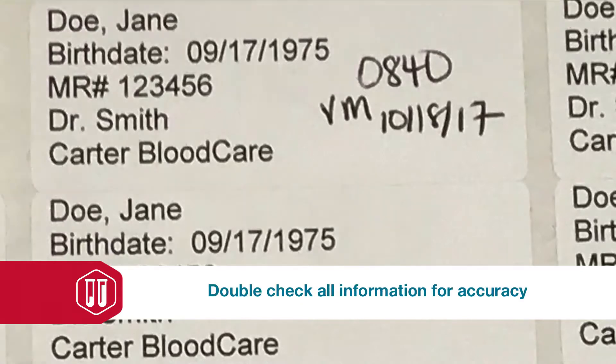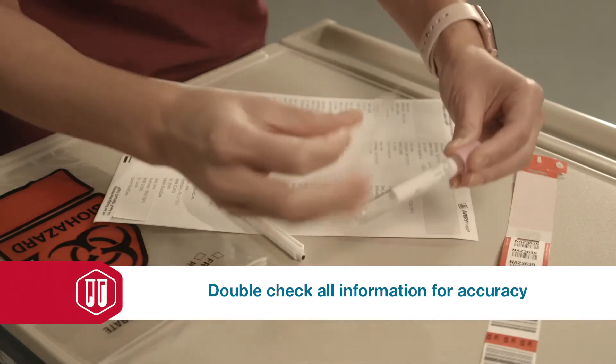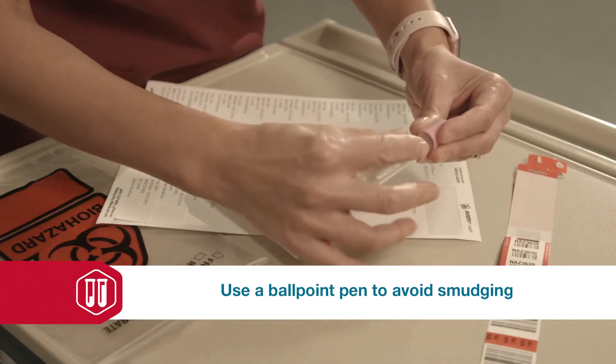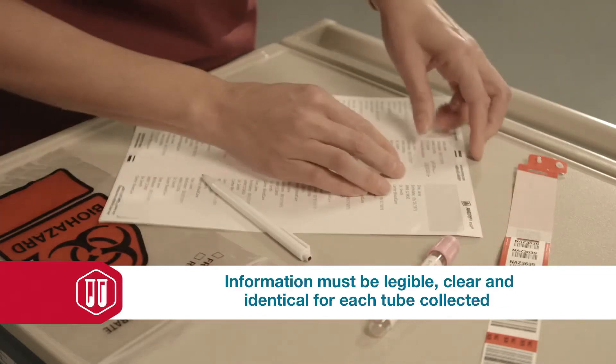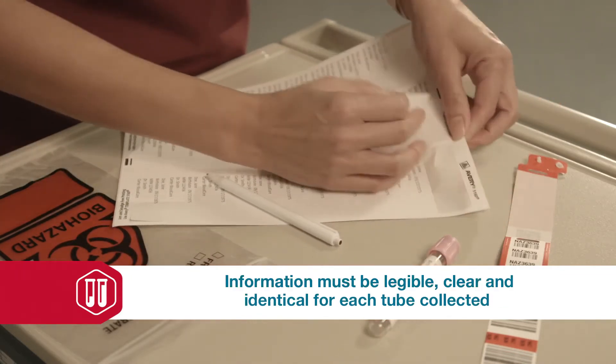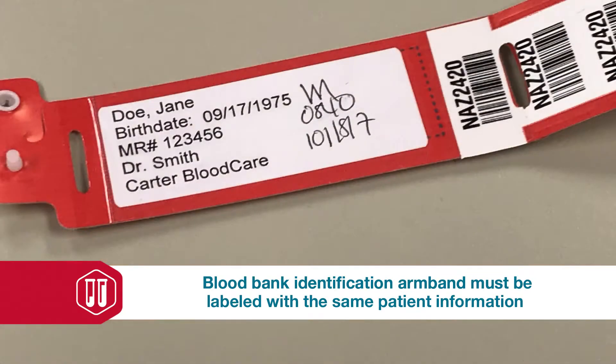If you choose to handwrite the information, please double check to make sure there are no spelling errors and the information matches the hospital armband. Also, please do not use any rollerball pens, markers, or anything else that smears, as the information must be legible, clear, and identical for each tube collected.